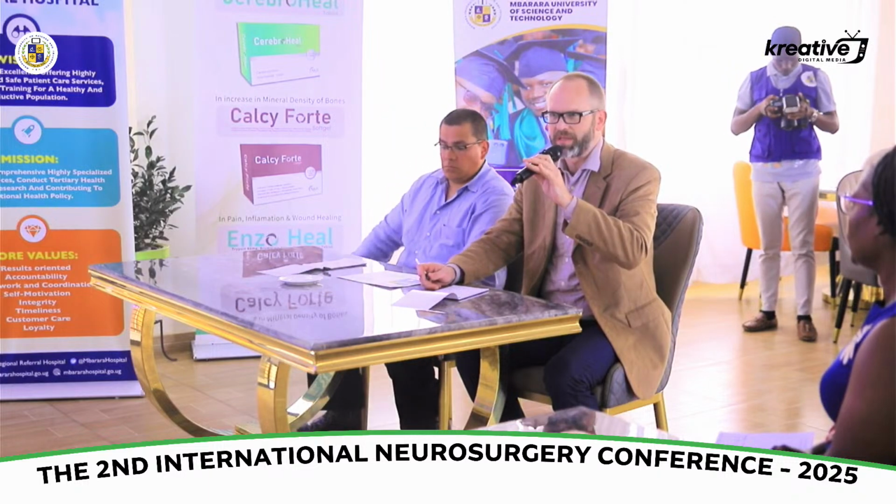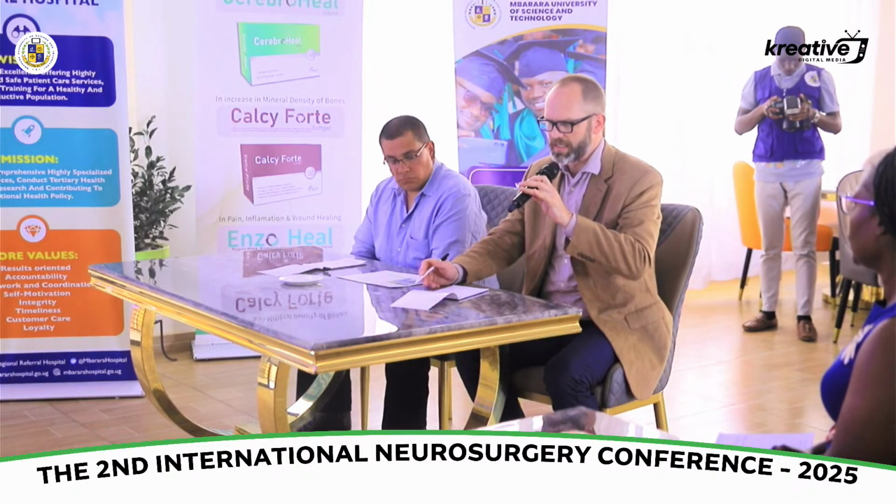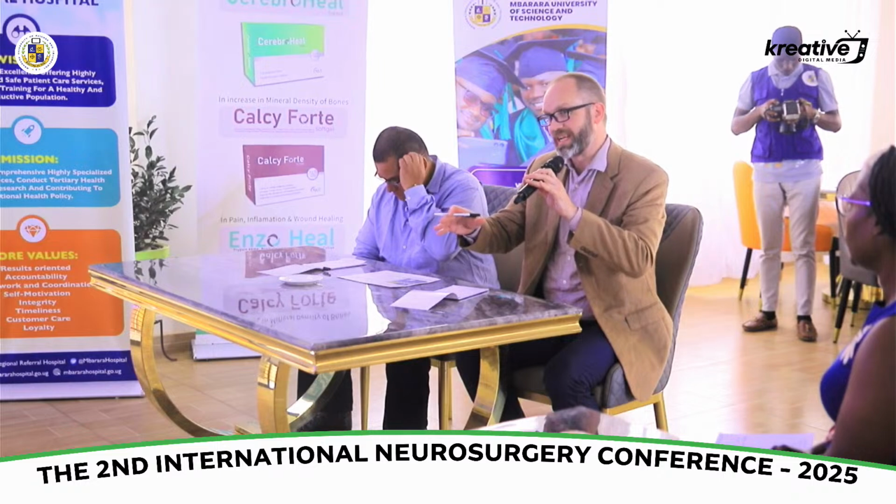So I'll just give an example. There's something called ultrasound localization microscopy, which allows you to use contrast ultrasound with microbubbles. So this answers the contrast question a little bit. We do use contrast in ultrasound of the brain, similar to cardiac surgery or hepatic surgery, so that can be useful. But you have to have a special machine to be able to view that.